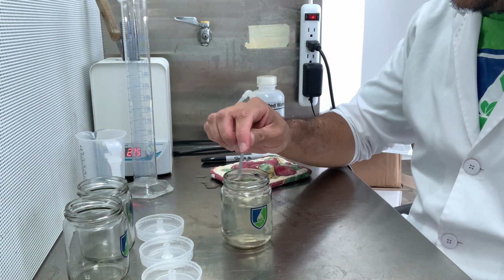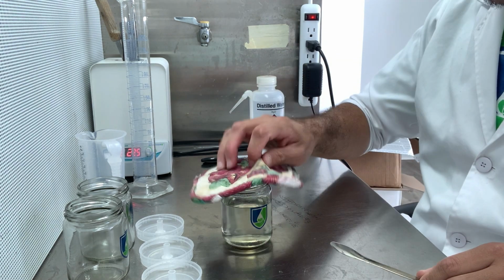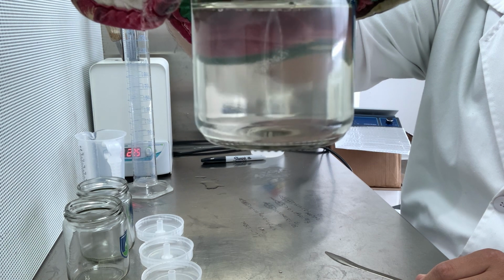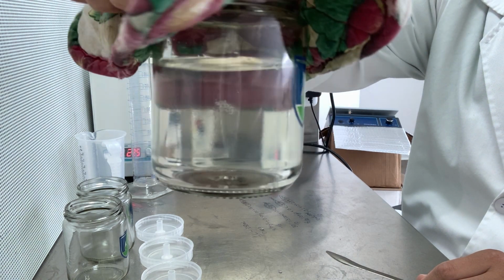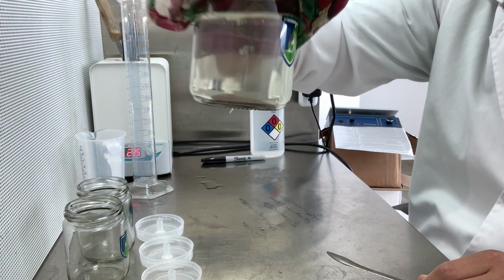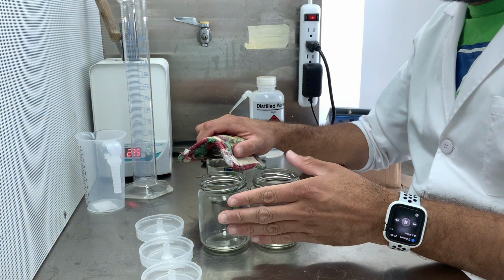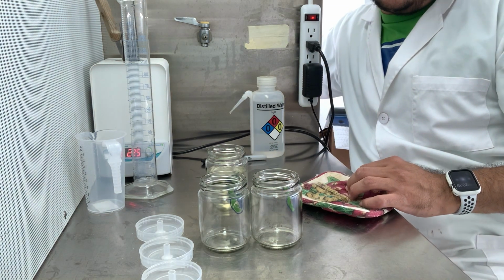Right, so it has been fully dissolved. As you can see, it is completely clear. There is no agar just floating around. It's completely dissolved. So now what I can do is just pour it into my other jars.